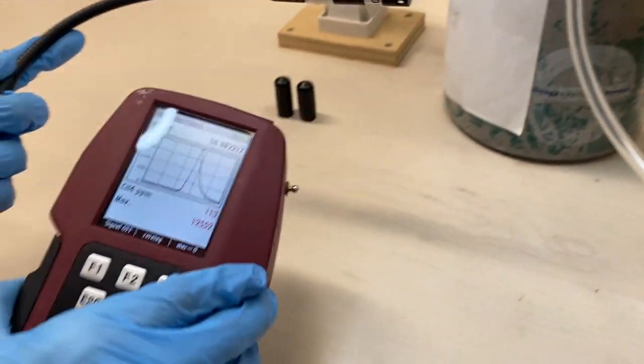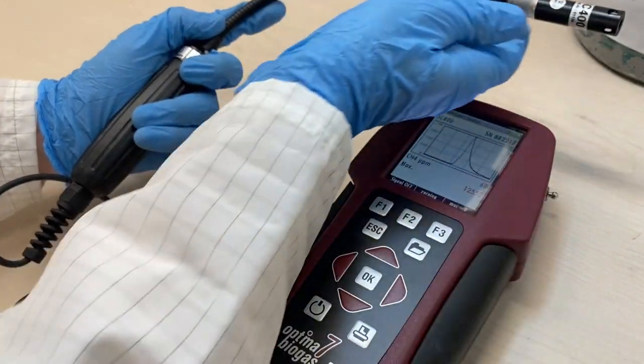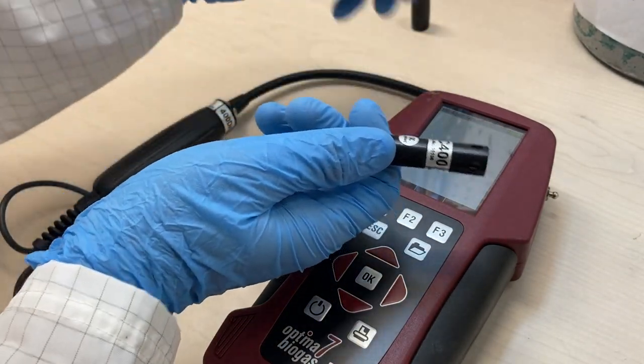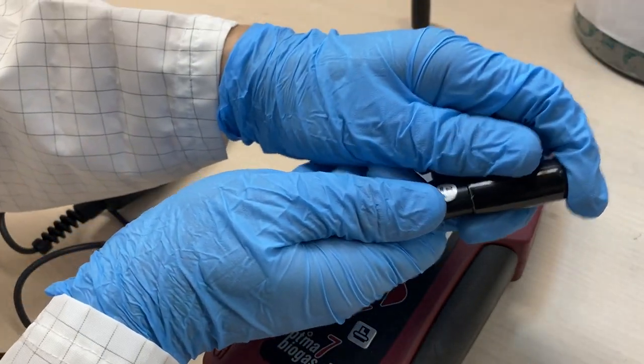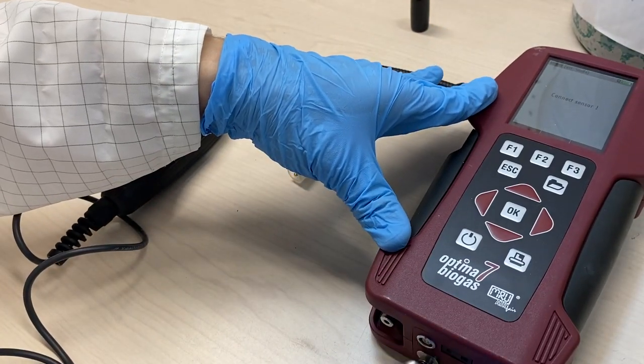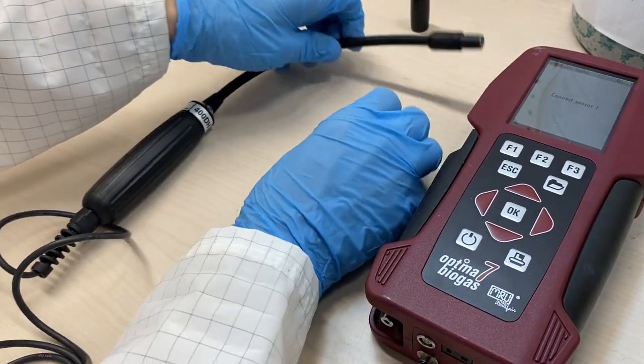When finished measuring, carefully remove the sensor and insert it into its protective cap. Remove the probe from the instrument and store it in a safe and secure location.